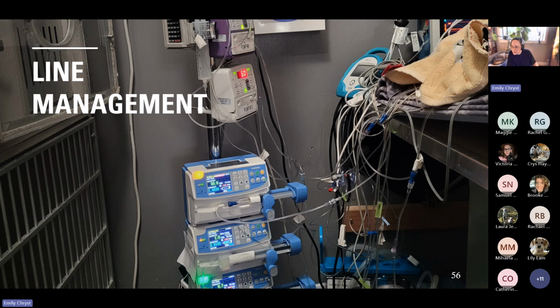Let's see. Is there a concern for using tie gauze? And should we be using something that can't house bacteria? I have not had issues with tie gauze, again, because we're changing it every 4 hours. Every time I do endotracheal tube care, I change that tie gauze. But it's just a function of what I used previously.